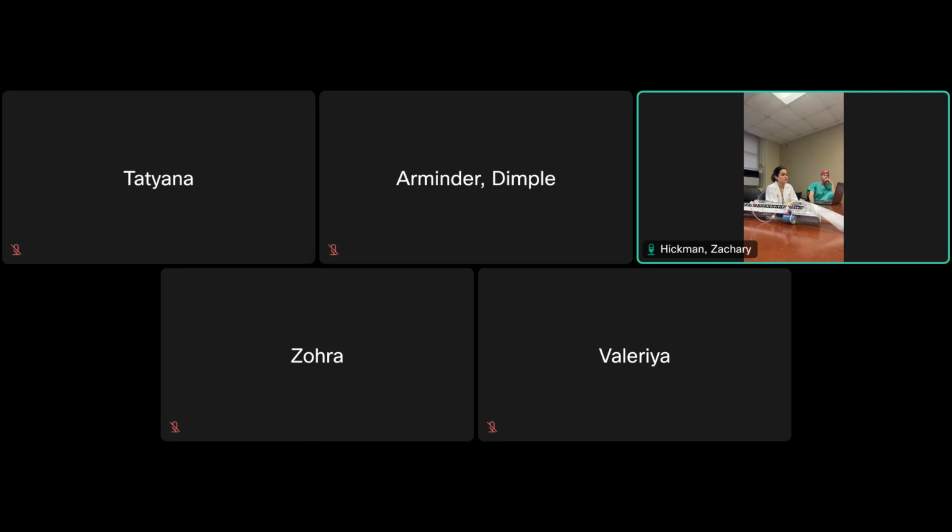to document how good the placement is. An ideal placement, again, is like you said, the tip at the foramen of Monro, or maybe slightly in the third ventricle. But then there are other less optimal ones, like potentially having it going across the septum pellucidum and into the contralateral frontal horn, where it still works. It's just not necessarily as good. There are times when you might actually want that, if you want those two to communicate, if you have IVH and whatnot. So that's one.